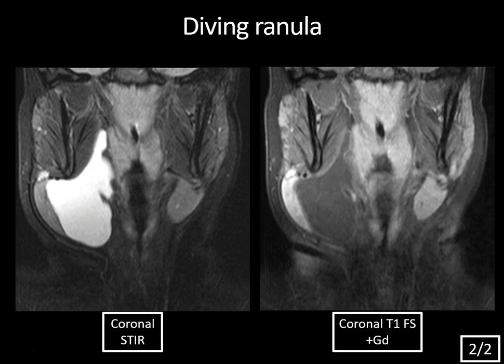We don't discretely see the mylohyoid muscle on these images because of the angle of imaging. But the mylohyoid is like a sling or hammock at the floor of the mouth that arches superior to the submandibular gland. So even though we can't see it, we can assume the ranula is piercing through the mylohyoid muscle — typical for a diving ranula. These are typically treated with surgical resection.